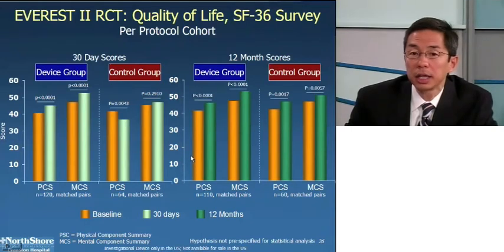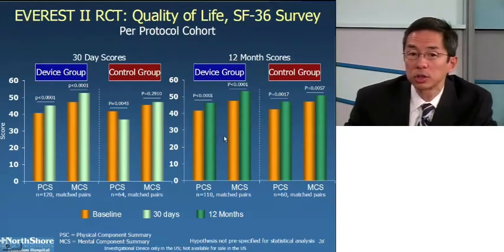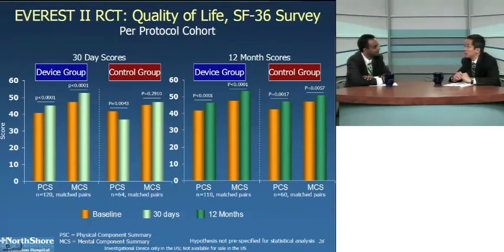And by a more objective quality of life questionnaire, you can see, again, an improvement here at 30 days in the device group, with, interestingly, a slight reduction in the surgery group, again because of the recovery time from surgery. But at 12 months, a very similar improvement, both in the physical component scores as well as the mental component scores of the SF-36, for both the percutaneous device as well as the control group. So, again, to reiterate, a somewhat safer procedure, less effective if you are quantitating mitral regurgitation, but the clinical benefit seems to be present. Again, this is a short to intermediate time endpoint, and whether this holds up over time, I think, will be a very important question.